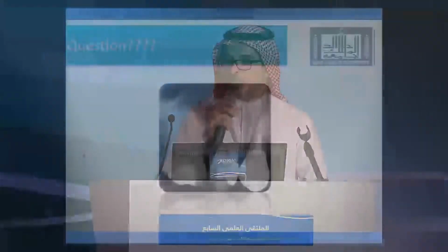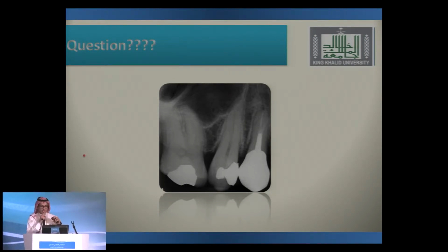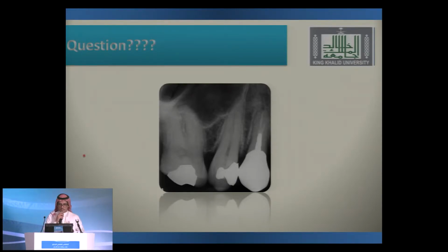Can you give me more attention, because I can ask you like my student, I'm a student like all of you. When you see this patient come to your clinic with this tooth, upper second premolar, the root configuration and the root form are not clear. So inshallah, throughout my lecture, we will diagnose this case and treat it.